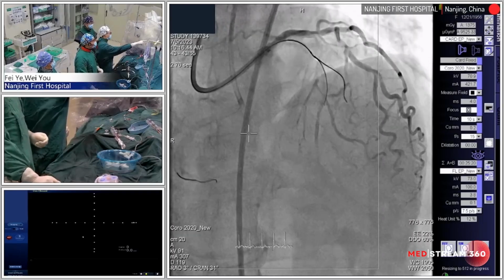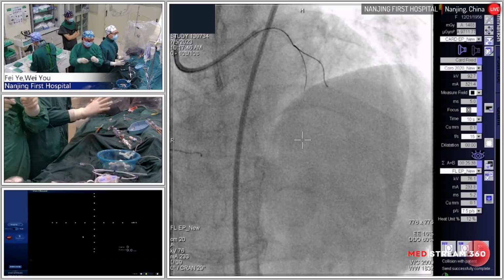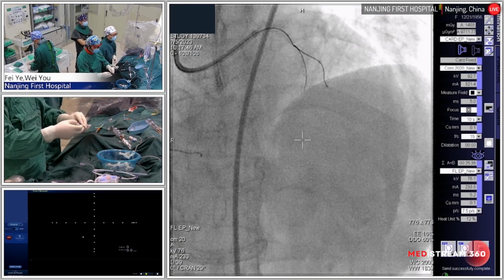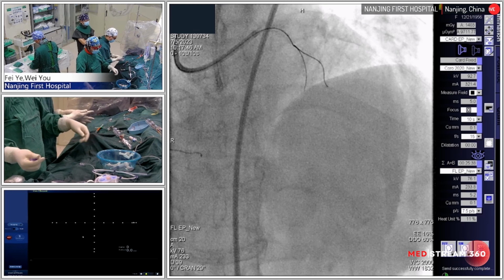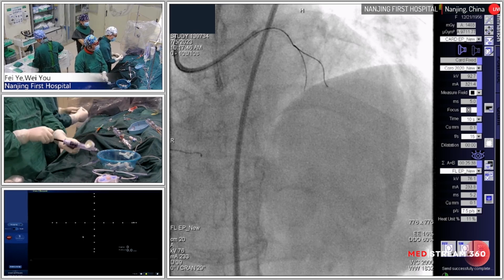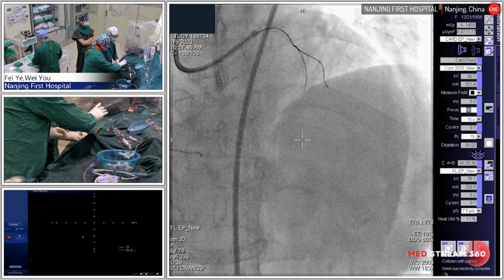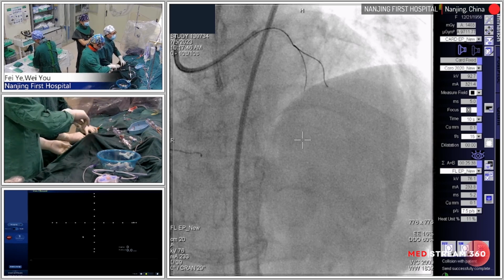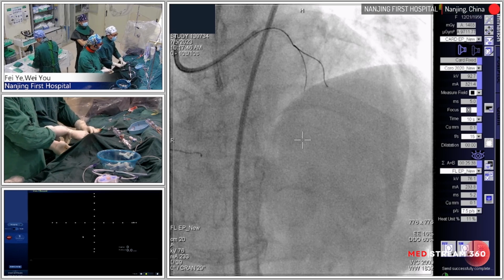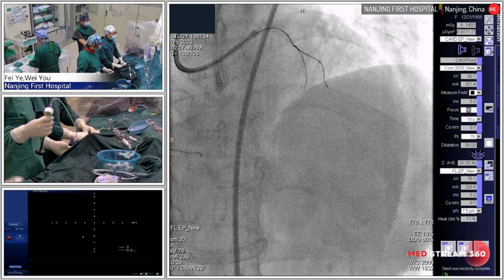It's different from the previous channel. I just want to go nearby the septal side, because of the very sharp space, so it cannot tolerate the two. Although I use the Sasuke or Gaia microcatheter, the seesaw technique with the Fine Cross is also suitable, but it's a very sharp space that cannot tolerate two microcatheters. So the seesaw technique will not work, I think. That's why I just want to retrieve the previous microcatheter.